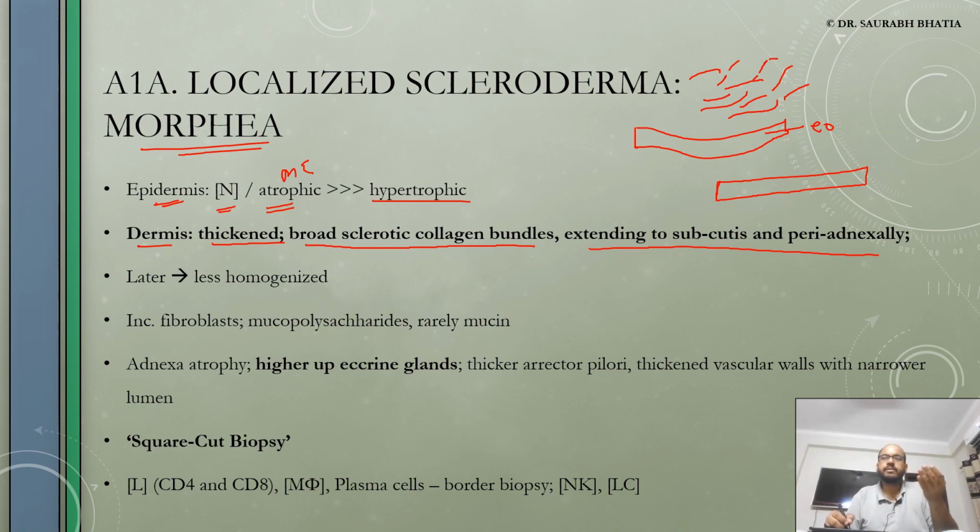You will see that they are equally stained, paler, not exactly the bright pink that you usually see in a normal biopsy, and this is very essential. I'm going a bit off topic, but if you're looking at a biopsy in which the dermis is normal, appreciate how normal collagen looks, because if you know what the normal structure is, you can easily find problems when there are disorders.